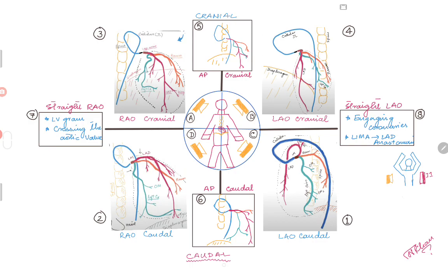Looking at picture one here at four o'clock, we are identifying the view by looking at the catheter. The catheter is coming below the diaphragm, so probably femoral access, and the catheter is open in an L-shape, so it's probably an LAO view. Since you don't see the diaphragm in the middle of the image, it's probably a caudal view — so LAO caudal view, exactly the view shown in this picture.